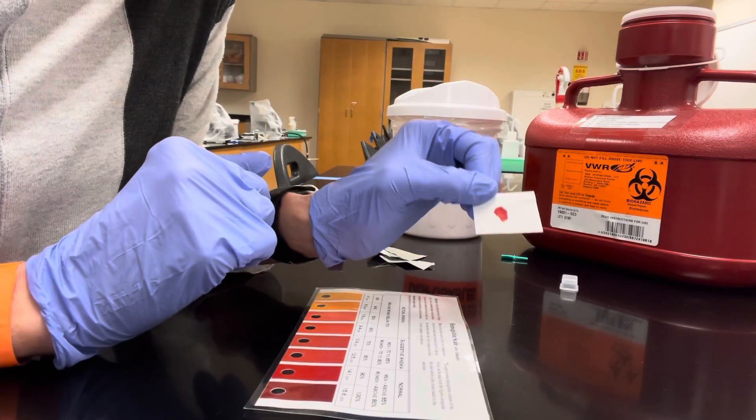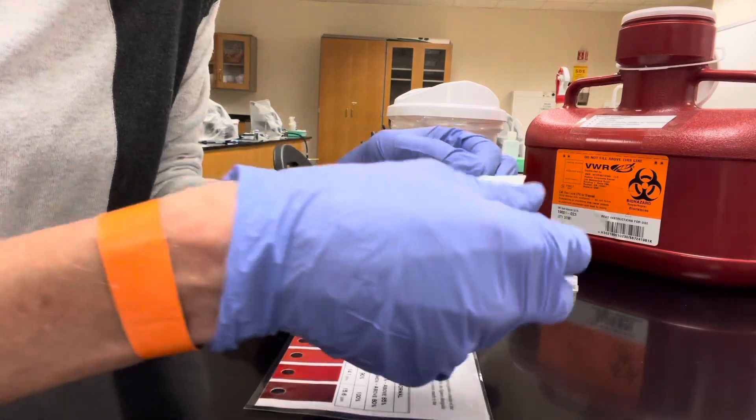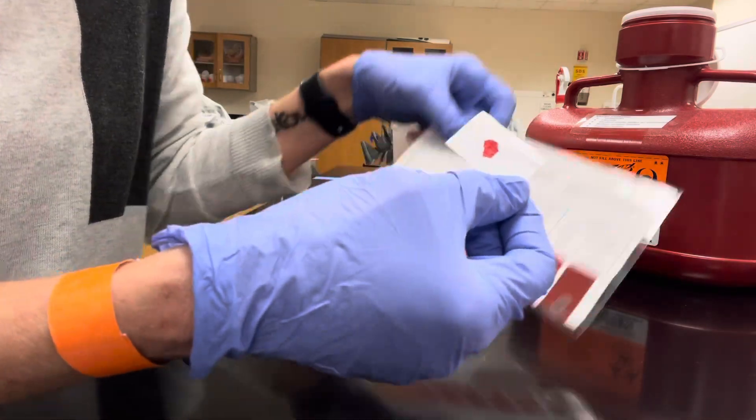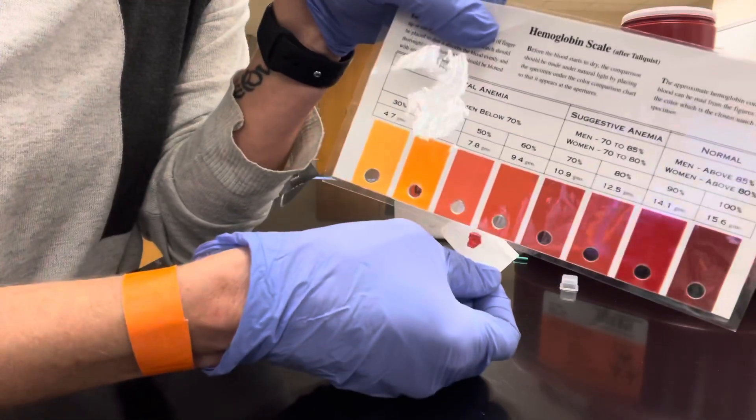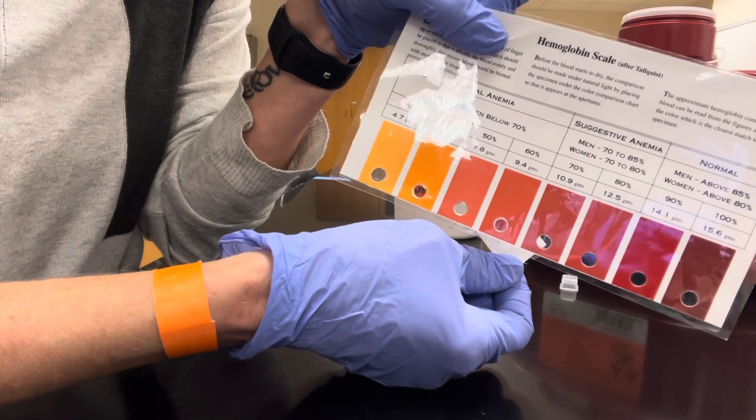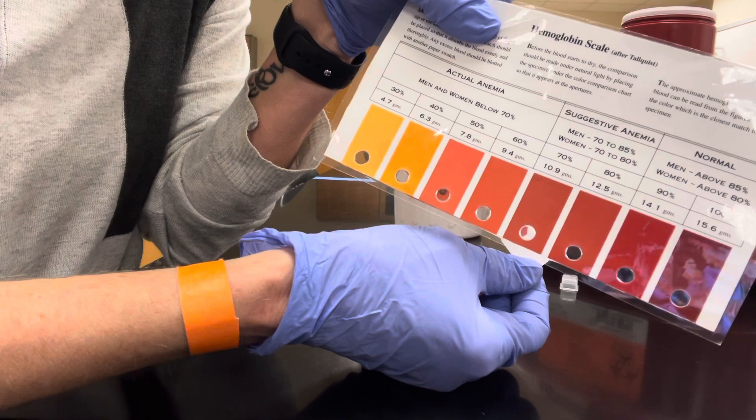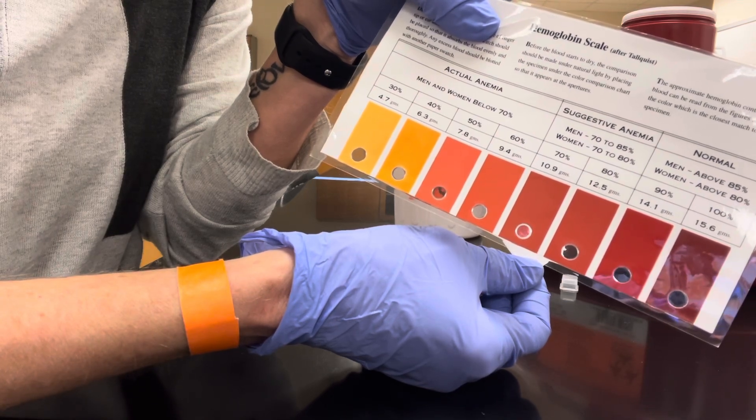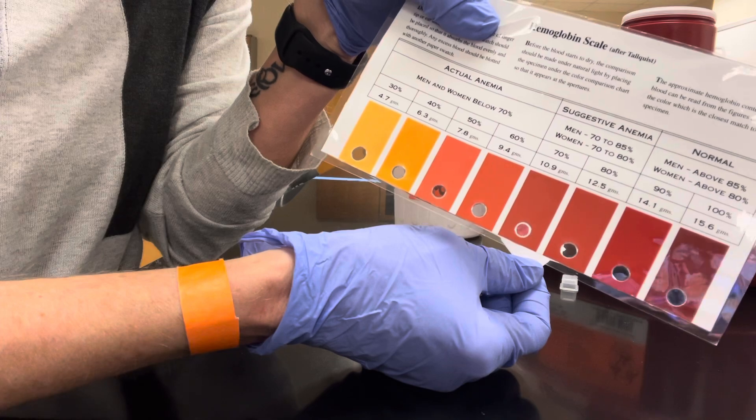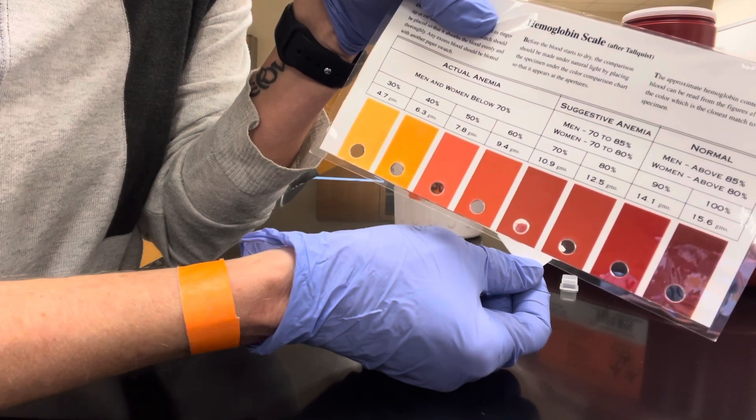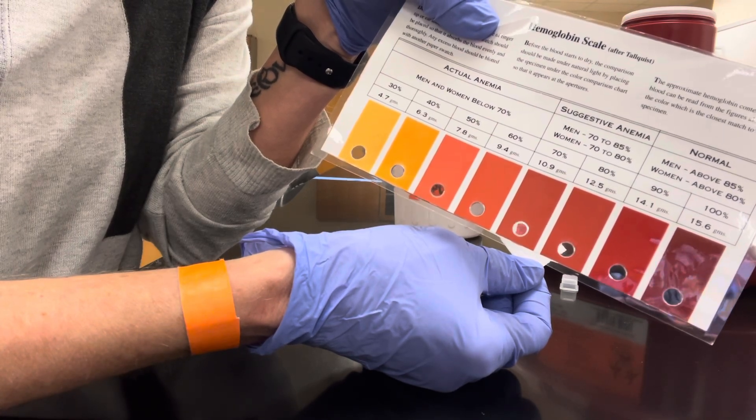As soon as the blood has dried and lost its glossy appearance, you're going to compare it to the hemoglobin scale. You do this by looking at the colors. Hold your Talqvist paper away, but underneath the hemoglobin scale. We don't want to touch blood to it. Match the color and record the corresponding concentration of hemoglobin.